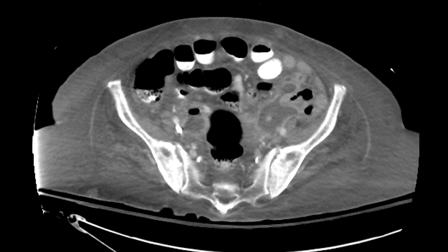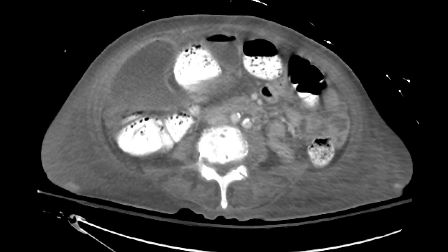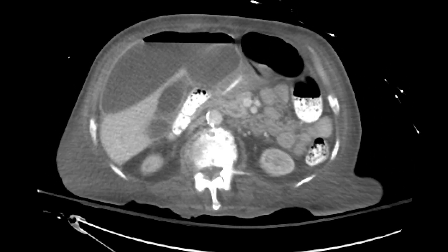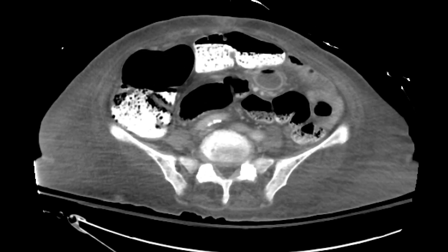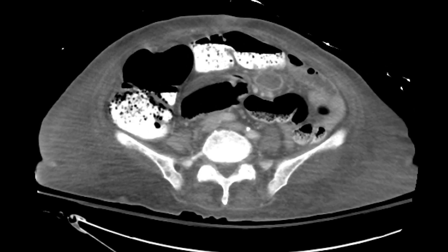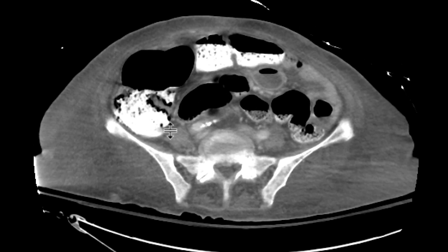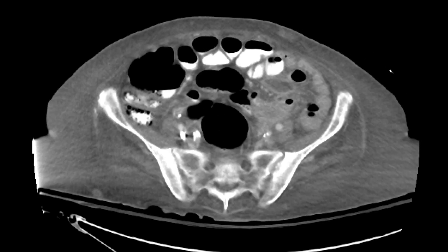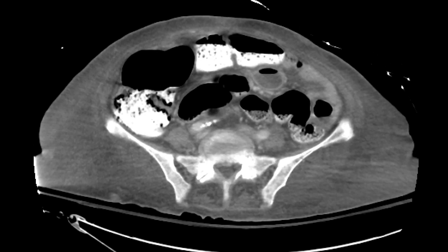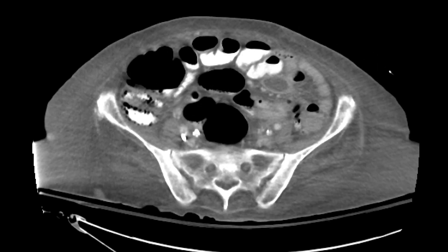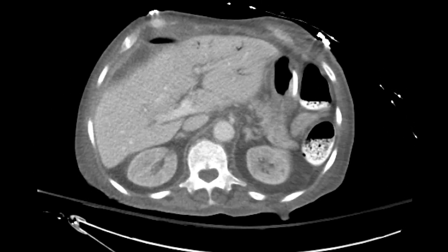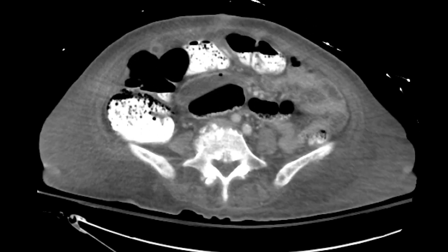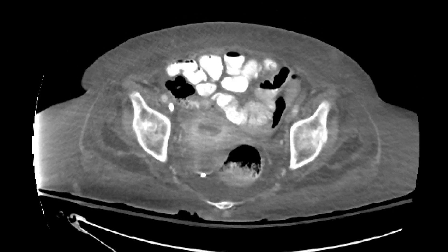This is a case of perforated appendicitis with numerous abscesses, many of which are communicating with one another. Looking at the cecum, we notice gas within the wall along its dependent portions — findings highly concerning for pneumatosis. The patient likely has cecal ischemia with resulting portal venous gas, as well as perforated appendicitis with numerous abscesses in the abdomen and pelvis.